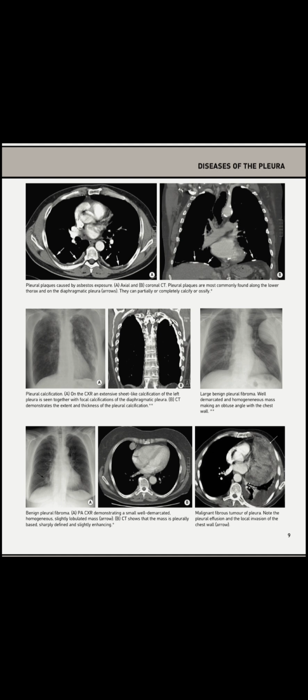And radiologically, these have a very distinctive look, as you can see there in images A and B on a chest x-ray. It shows up as a pleurally based mass. It's usually well demarcated, maybe slightly lobulated. And here's a fascinating clue. Sometimes you see marked positional variation. Meaning it moves around? Exactly. If it's pedunculated, attached by a stalk, kind of like a mushroom growing off the pleural surface, it can actually move with breathing or changes in patient position. That's a really powerful clue, almost a signature for these benign tumors.